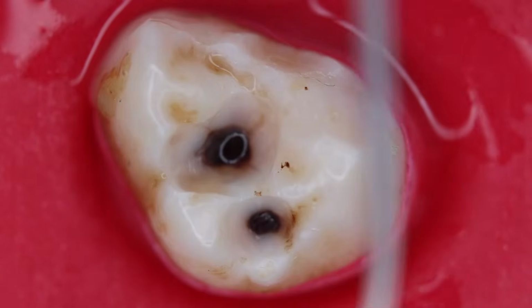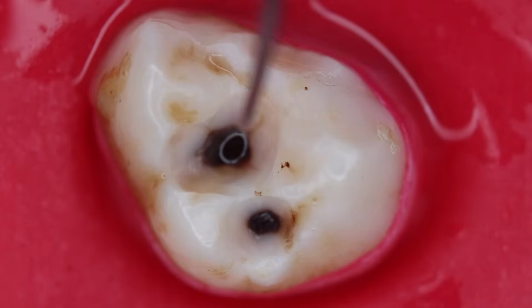See how intermittently you are removing the caries over here, and with the central approach, preserve the sound tooth structure as much as you can.